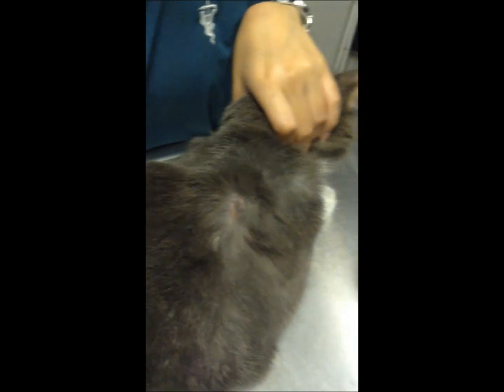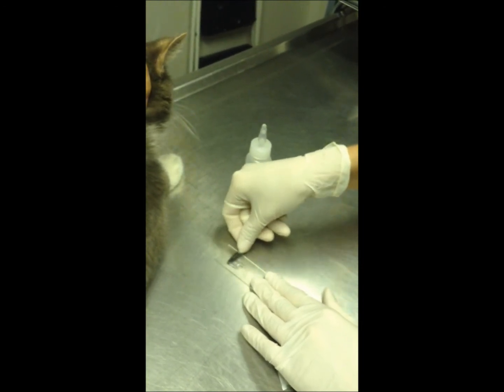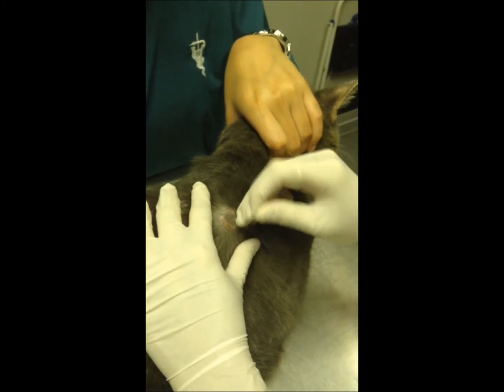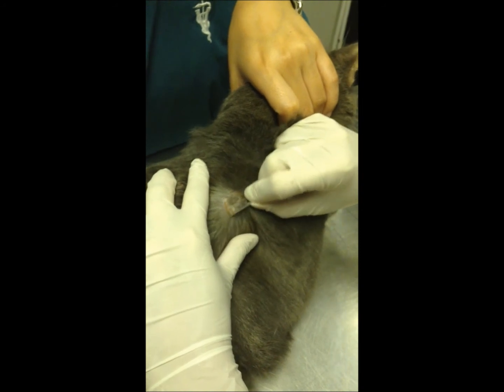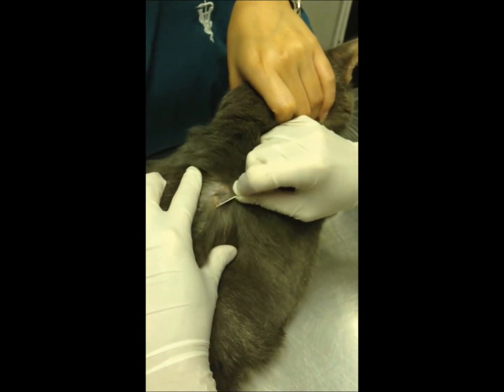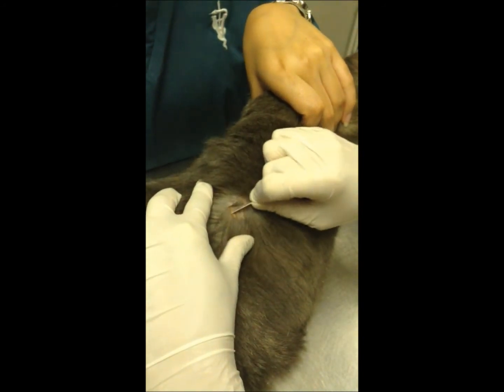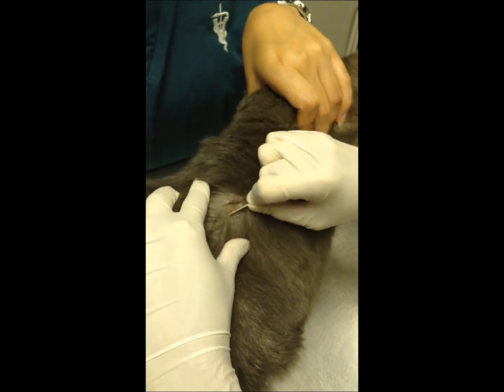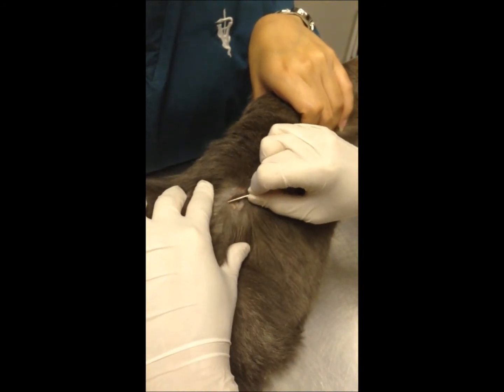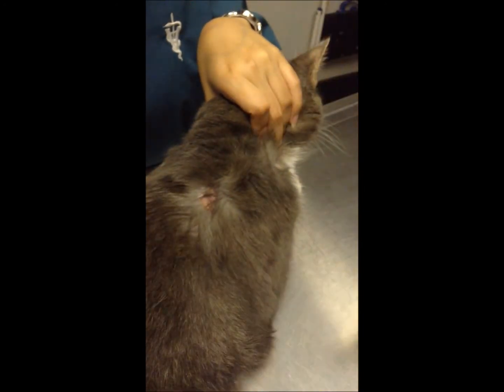So you need a little bit of mineral oil, and you're going to put it on the slide. And you use a 10 blade, and you get some of the oil on the blade, and I'm wearing gloves just as a precaution, because you're not totally sure what the animal has, and you're going to scrape in a vertical motion, and you want to do it deep enough so you get a nice sample. A lot of the times when you're looking for mites, you want to make them actually bleed because you know that you're getting deep enough. So we have a sample on there.